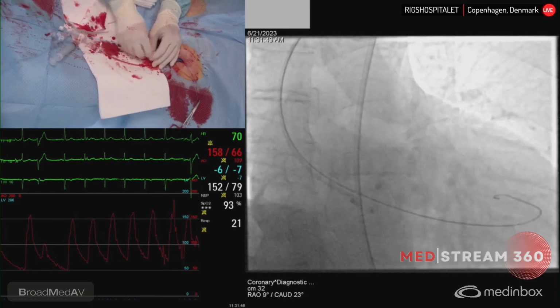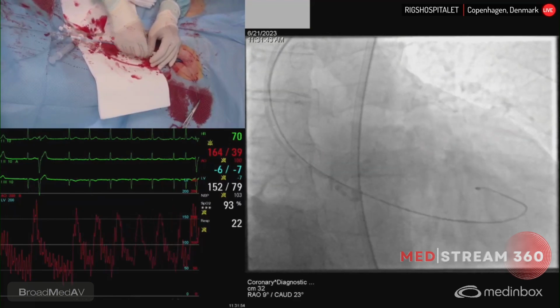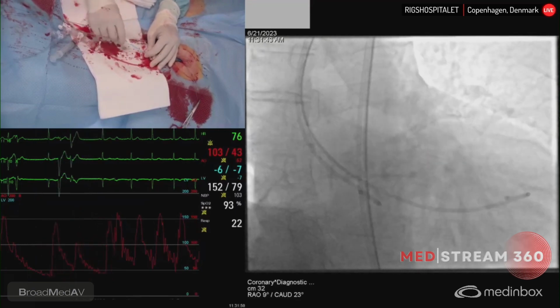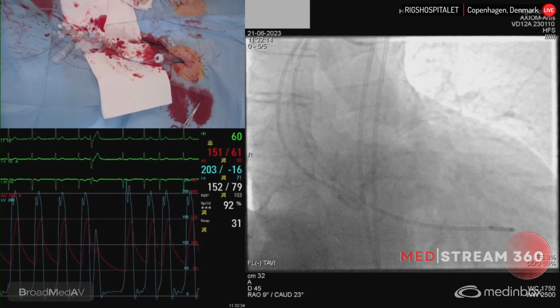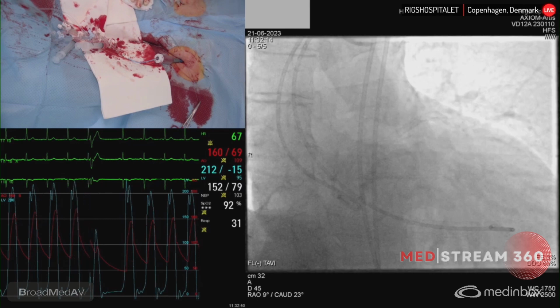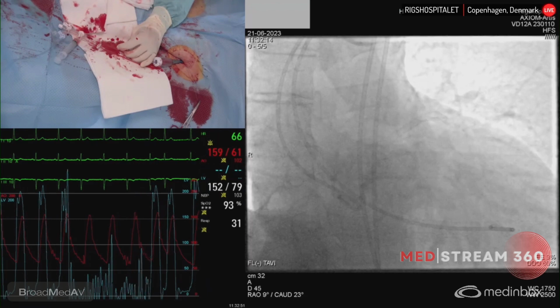So we like to change it to the pigtail just to assure you're out of the mitral chordae to do a proper hemodynamics measurement. So now we push the pigtail in. Yeah, that's it. That's good. Let's do some hemodynamics. So peak to peak 54 in the LV, and we have end-diastolic 25 and 63. Yeah, good. So he's not too dry. He's preserved ejection fraction. So I think he's euvolemic. He's not underfilled. He's not too much overfilled. I think it's good. We don't do anything special here with the fluids.